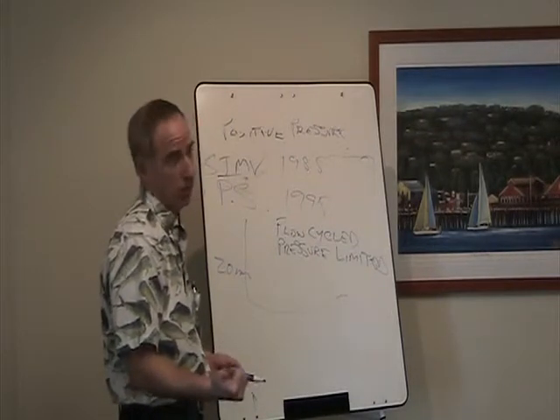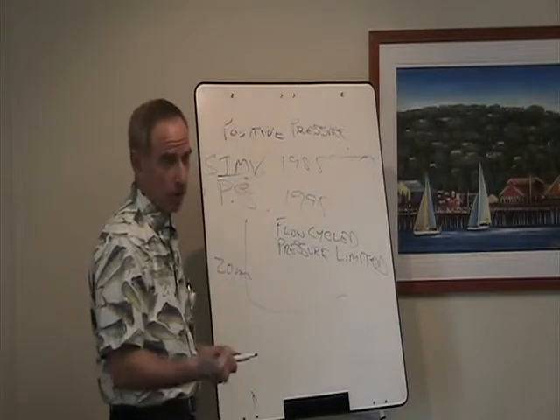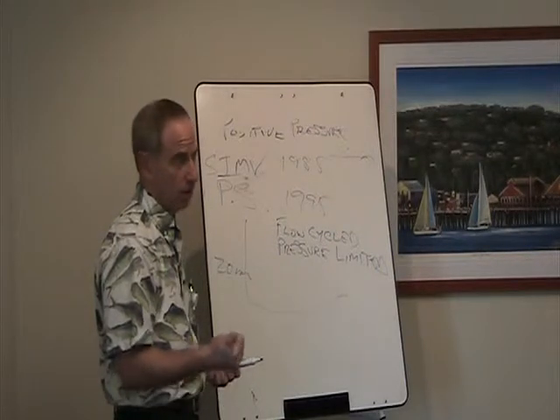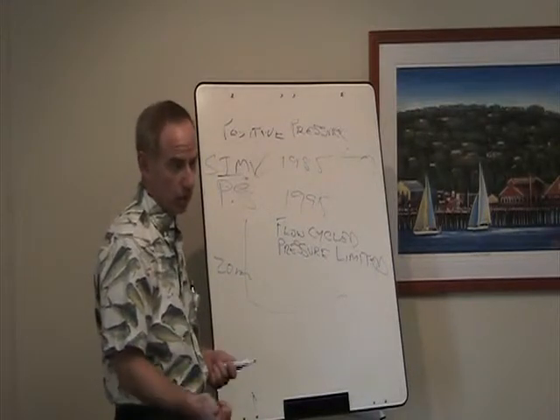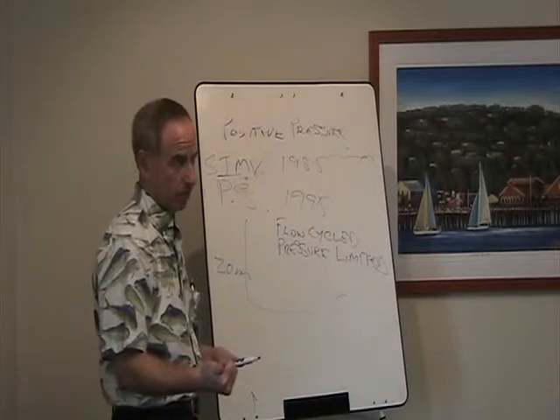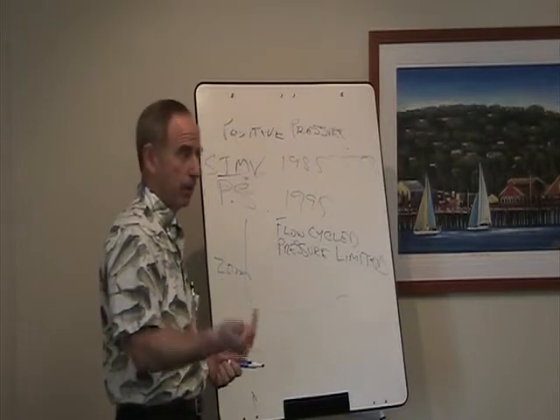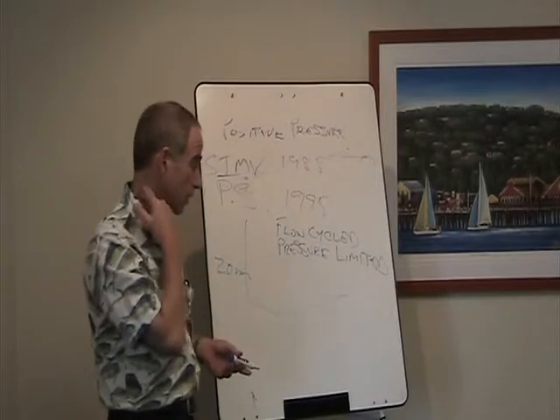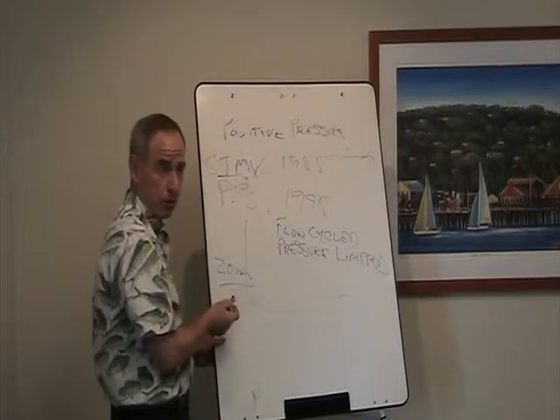You don't set a rate with pressure support. You have to have a spontaneously breathing patient. If you put a patient who's not spontaneously breathing on pressure support, they will be apneic. If you have them on a neuromuscular blocker and you put them on pressure support, they will be apneic. They will get no ventilation. So they have to be spontaneously breathing, with a spontaneous rate, and they have to initiate the breath enough to trigger the ventilator. You can set the amount they need to generate to trigger it, and it will give them whatever pressure you've dialed in.